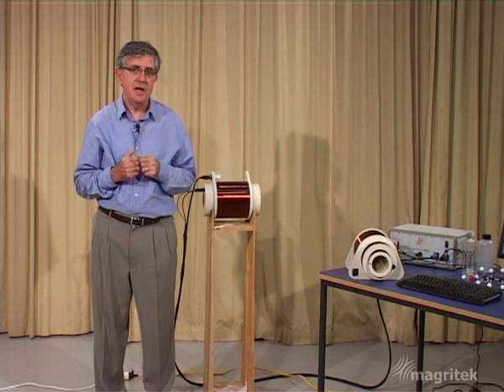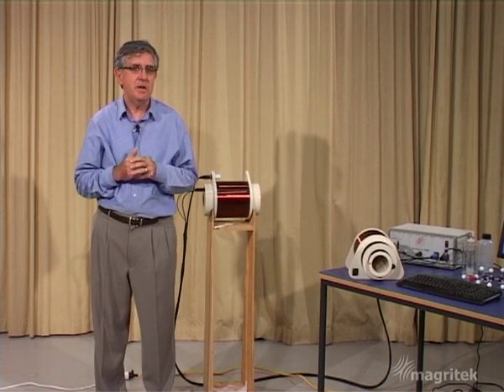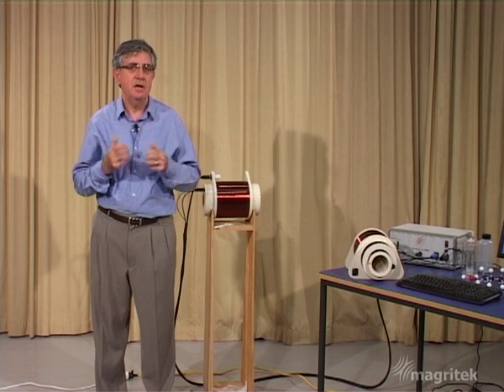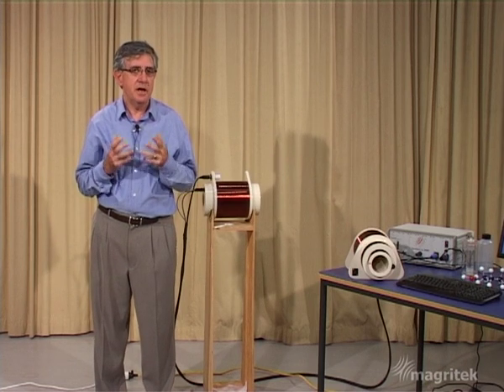Why does that static field have to be homogeneous? I'll leave that as something for you to think about, but it has to do with the sharpness of the resonance — the degree of resolution that's possible with nuclear magnetic resonance.